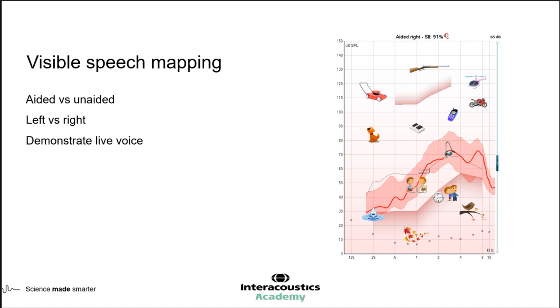So you could take the caregiver or the loved one, wife, husband, parent, whoever has accompanied the patient, and use their live voice and demonstrate how the hearing aid works with that. That's so much more useful than our own voice because they're not going to be listening to the clinician once they've walked out of the clinic. And I think that then helps to demonstrate how the hearing aid is actually working with a familiar speech sound.